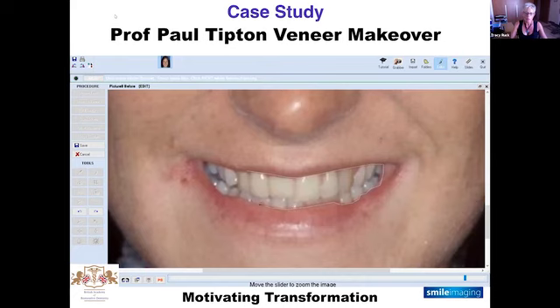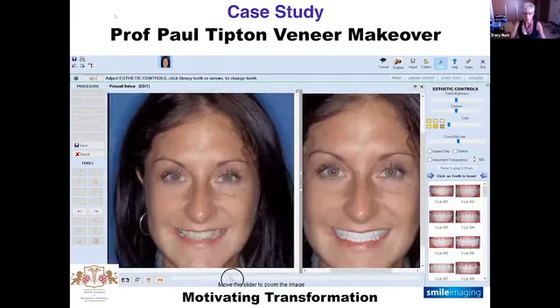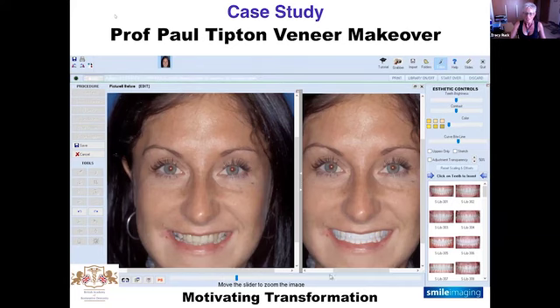Okay, and then once we have, follow the flashing instructions up there on the top left. It tells you to go to next, okay? So it's prompting you all the time in the software. And then we can zoom that slider bar in down at the bottom again. And as you can see, by default, as always, 301 goes in first. You can then click on the various teeth and get the shape teeth that you and the patient would like.